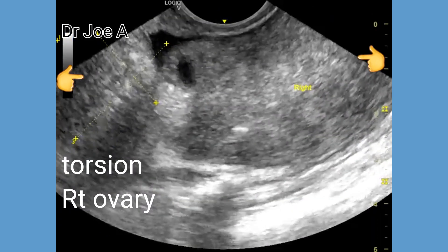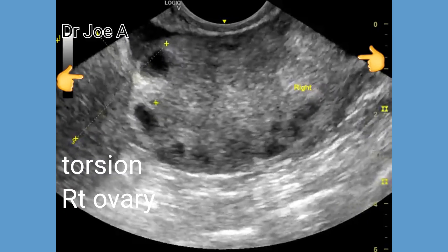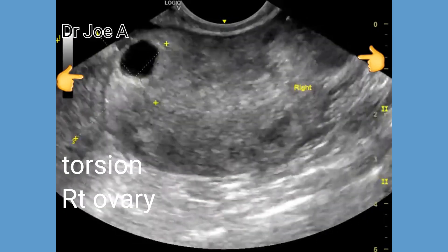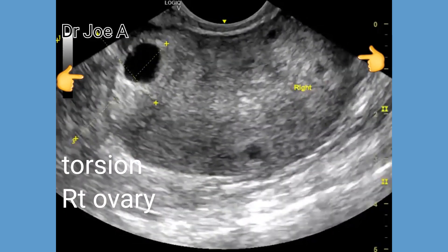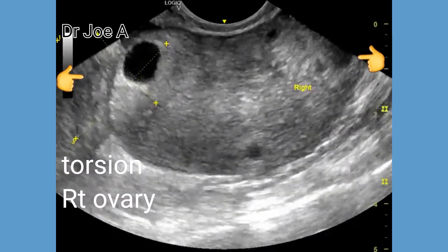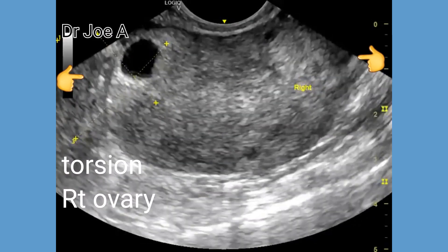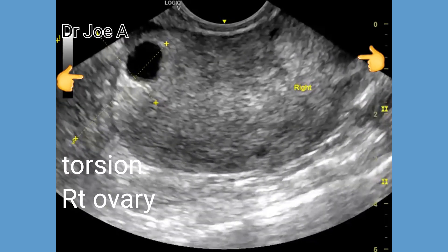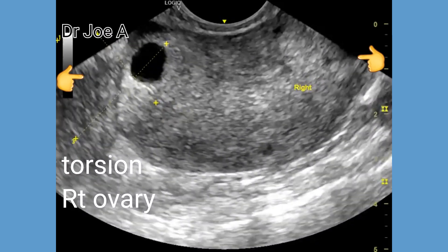Transvaginal ultrasound was done. The mass is indeed the right ovary, which is grossly enlarged at more than 22 cc in volume. A small amount of free fluid is seen around the right ovary.